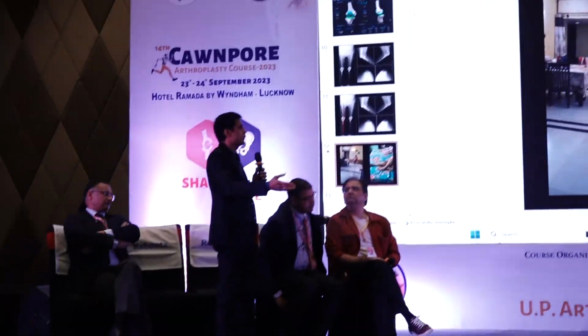If it is a varus, definitely you cannot take it to valgus or neutral. In fact, it is better to keep it 1 or 2 degrees of varus residual. Even 3 degrees of varus doesn't matter. But that varus has to be the clinical one and not the tray. You cannot put the tray.